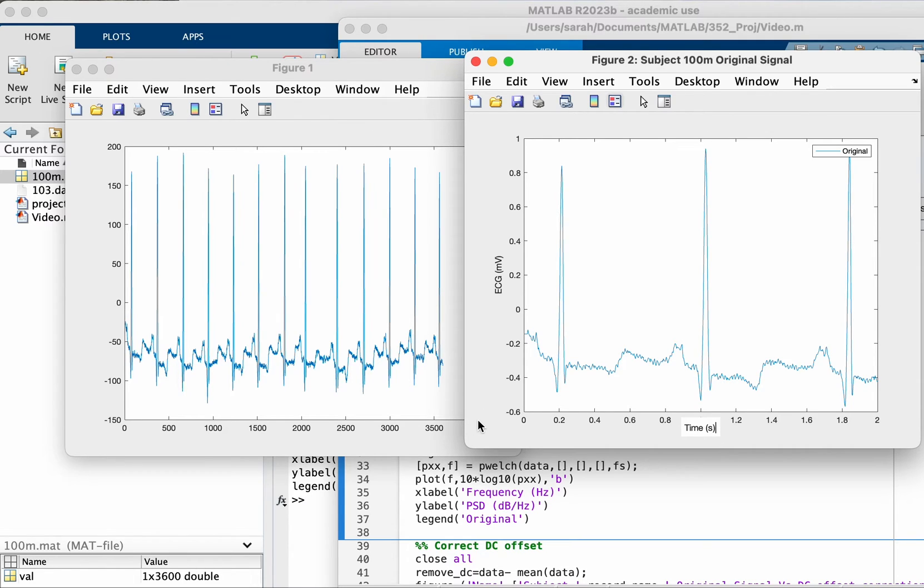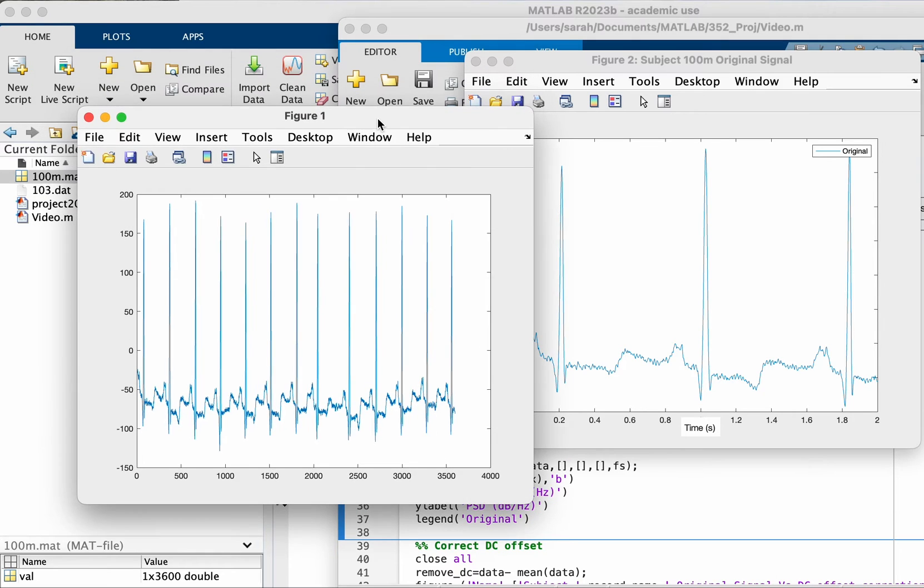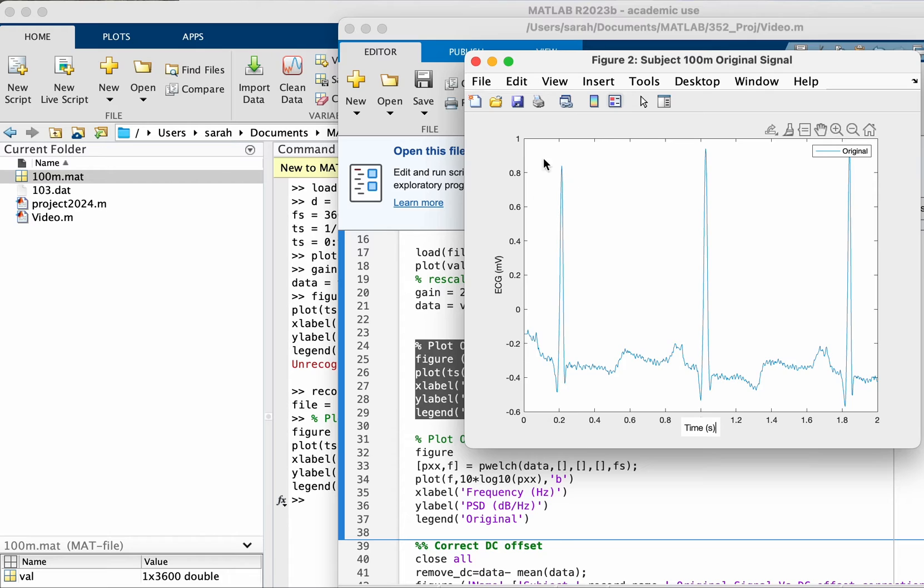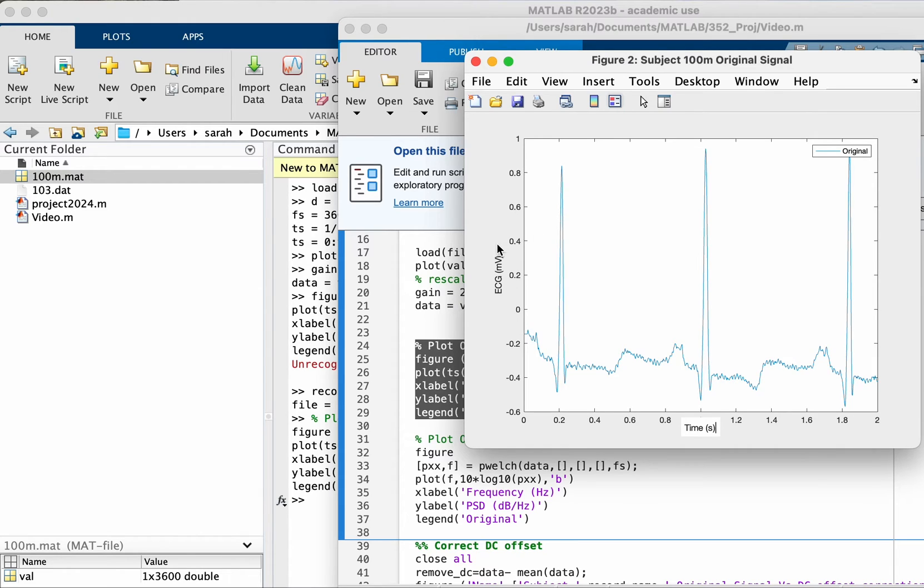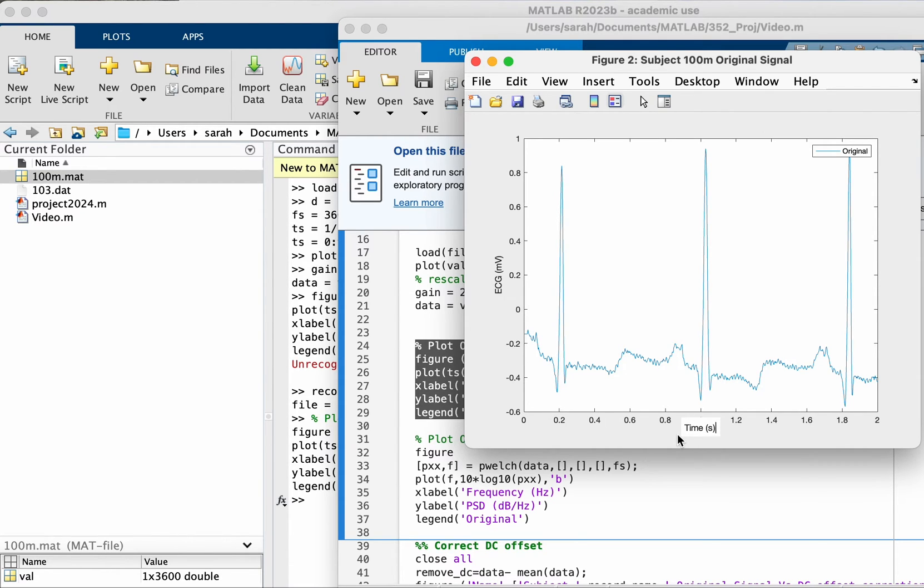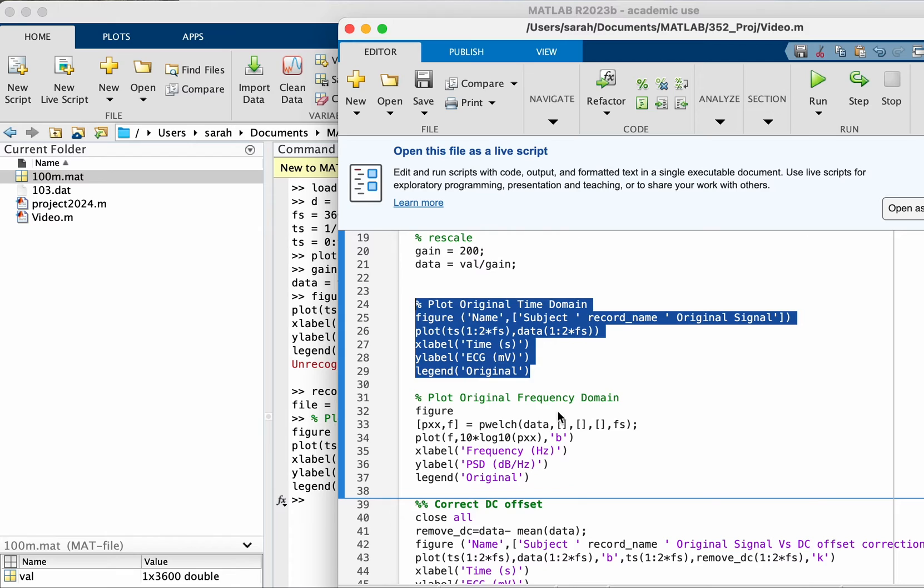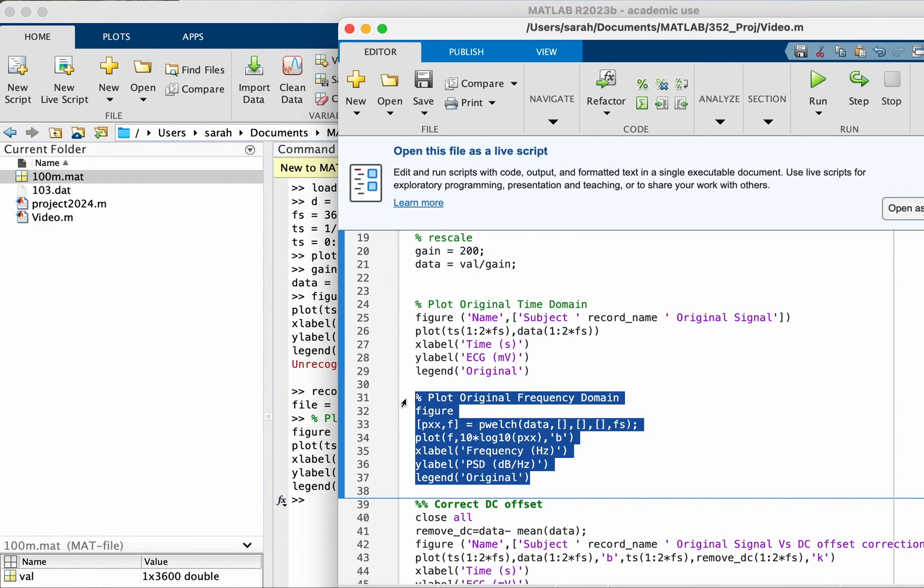If you're using PhysioNet or any other database, check how the signals were recorded, what is the sampling frequency used. So this was before we did anything, and then when we scaled down the signal to represent a biopotential signal with very small amplitude in millivolts.